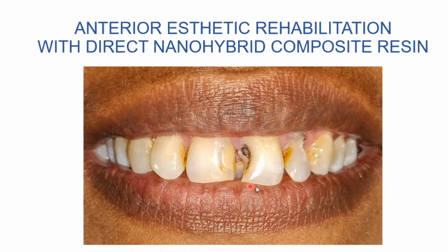You can see the smile line as well slightly drooping over the lower lip, right? So it's slightly overlapping the lower lip, which is how her overjet and her overbite are. So there's not much you can do about that. But obviously, you can correct these line angles and give them a good kind of a camouflage so that they look more aesthetic. Also, the midline needs to be corrected in this case.